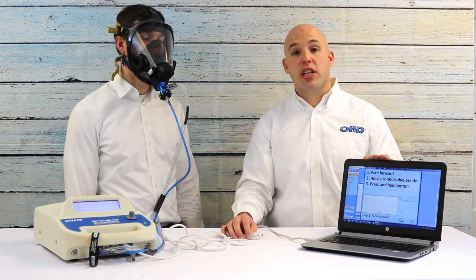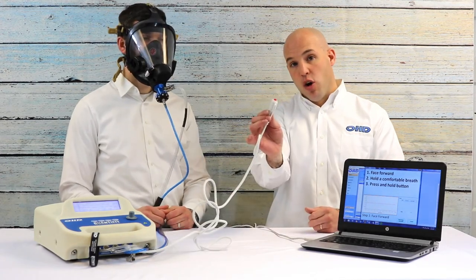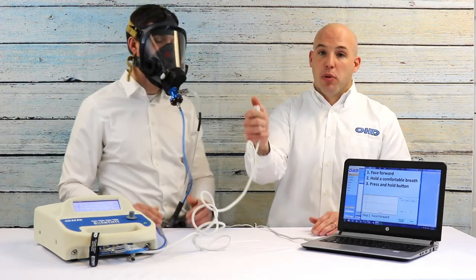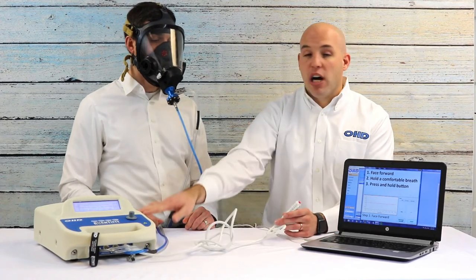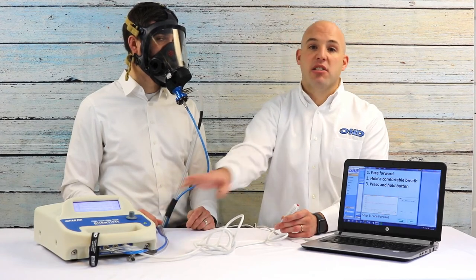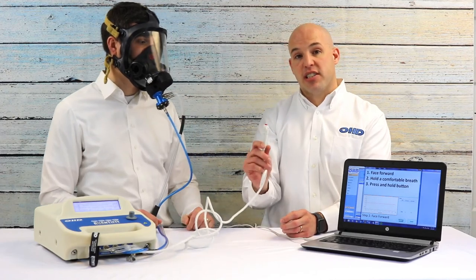First thing to notice — you'll have big, bold instructions on the software leading you through each step. On step one, all we want Luke to do is face forward, hold his breath, and press and hold the button that activates the instrument. The button is very simple: you press and hold it, the instrument runs for eight seconds on its own, and automatically stops when the step is complete. You will hear it stop, and it will quickly tell you if it passed or failed that step.